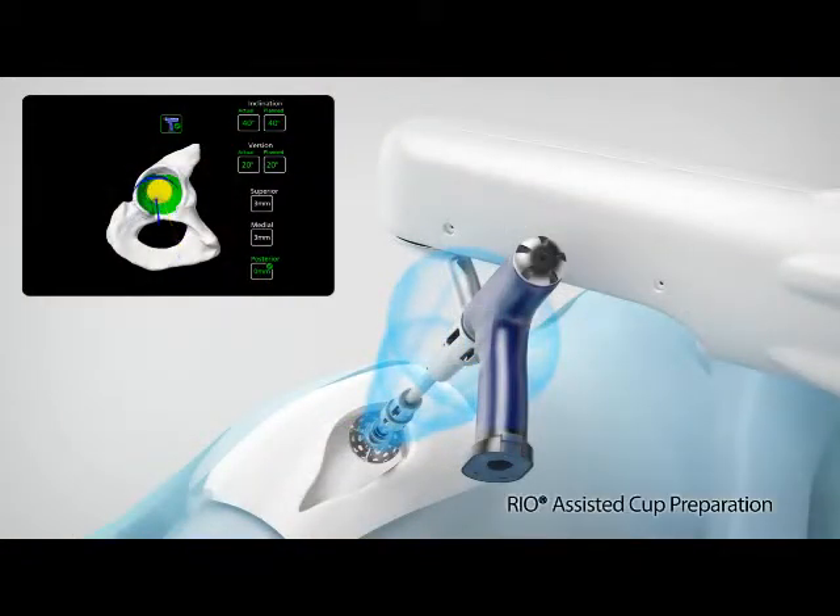During Makoplasty, the Rio provides tactile feedback, 3D visualization, and auditory guidance as the surgeon prepares the acetabulum for the implant.